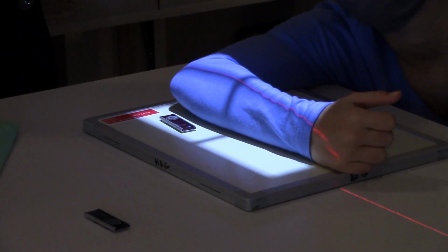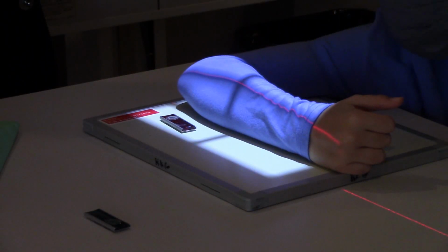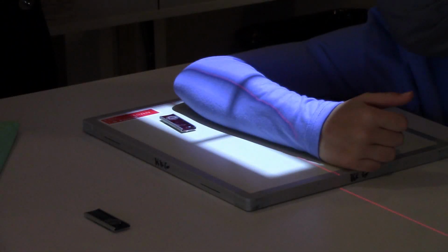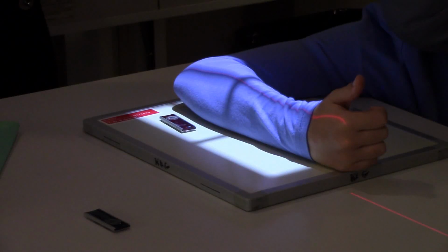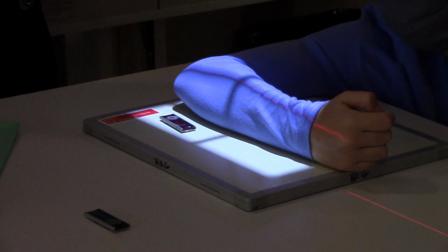We want it to be, oh, do you mean it's not exactly at a 90-degree angle? Okay, well, it would be nice if we had more of a 90-degree angle, so we'll get our patient to shift over just a little bit. There you go. Okay, and it looks like the shadow of the patient's elbow is all on the image receptor, so that should work.